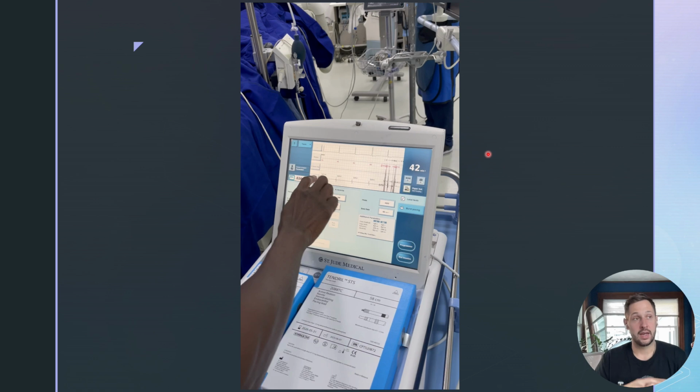Next, he went to his capture threshold, and he starts high. He comes down. I usually go 5 to 2 because I'm usually confident it's below 2, but not always, as we'll see later on, right? 5, had it at 3, 4, 2, went down to 1. We lost it at 1. So there we go back up to 2, and then we come down by decimals until you lose capture, and then you hit save threshold.